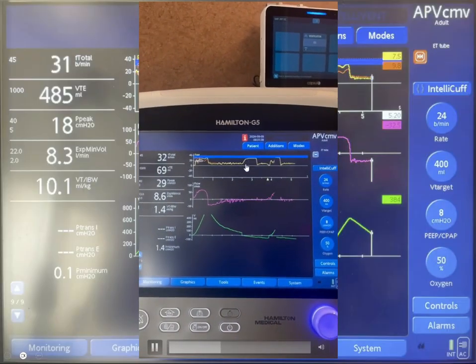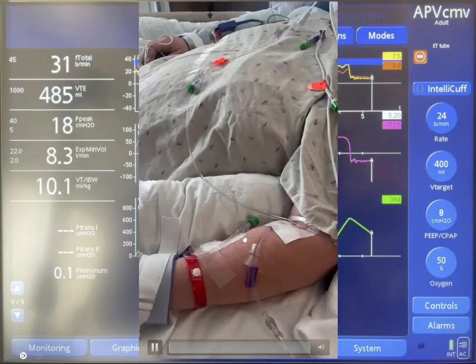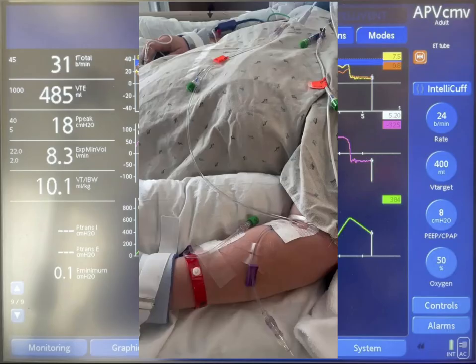This asynchrony is happening during exhalation. The way we managed this case was by paralysis. We sedated the patient with a BIS monitor and targeted a BIS score of around 40, paralyzed the patient, and completely eliminated this asynchrony.